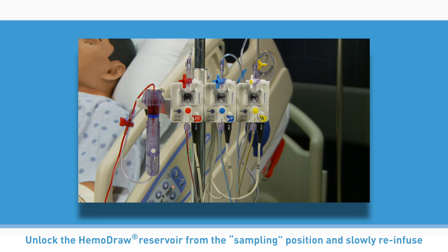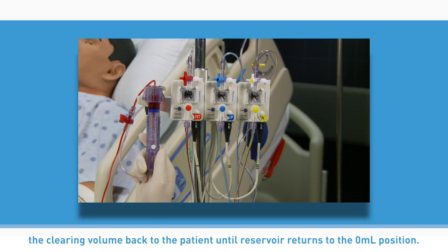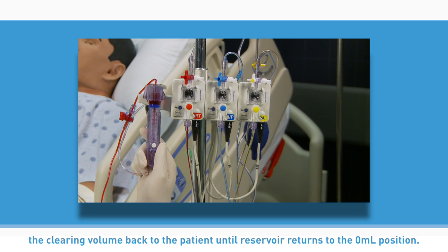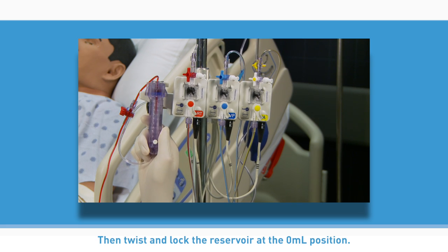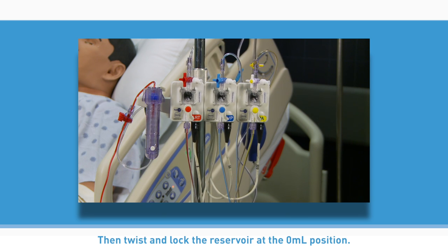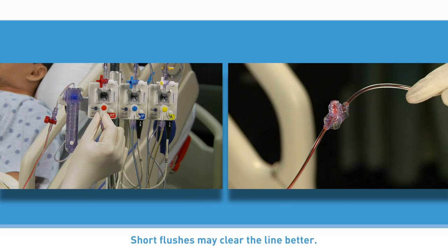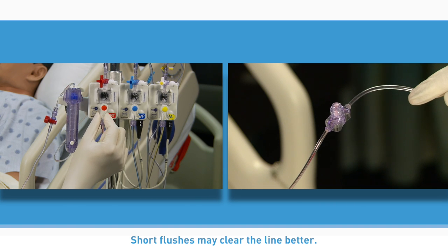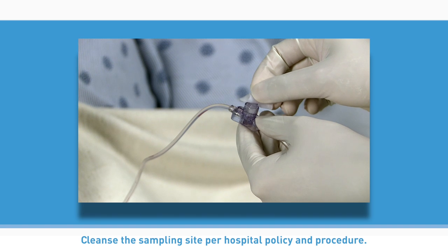Unlock the Hemodraw reservoir from the sampling position and slowly re-infuse the clearing volume back to the patient until the reservoir returns to the zero milliliter position. Then twist and lock the reservoir at the zero milliliter position. Activate the flush device until blood is cleared from the line. Short flushes may clear the line better. Cleanse the sampling site per hospital policy and procedure.